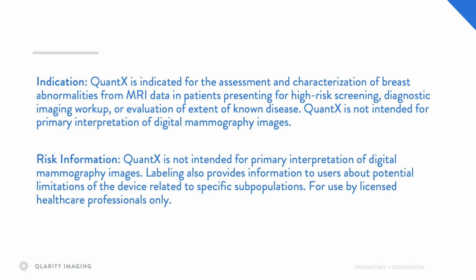Labeling also provides information to users about potential limitation of the device related to specific subpopulations for use by licensed healthcare professionals only.